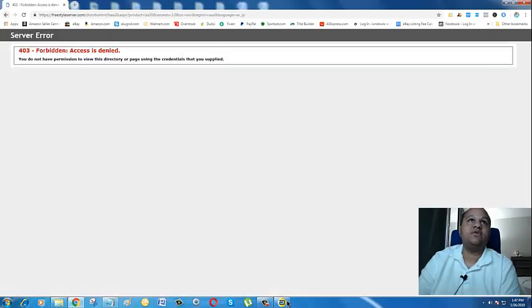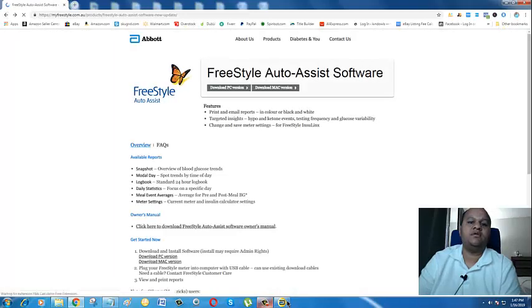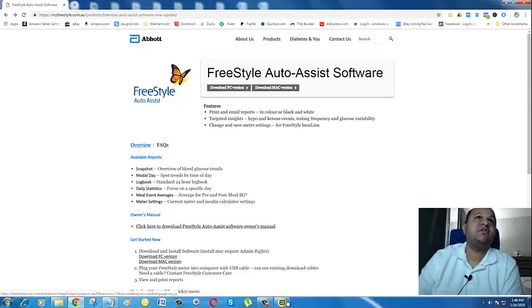If you have multiple people using the same software, all users will appear in the user list. Let's go ahead and check Read from Abbott BG Meter — this is exactly where it should be. Let's click on that.